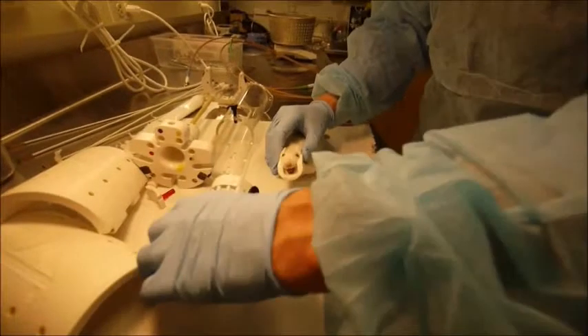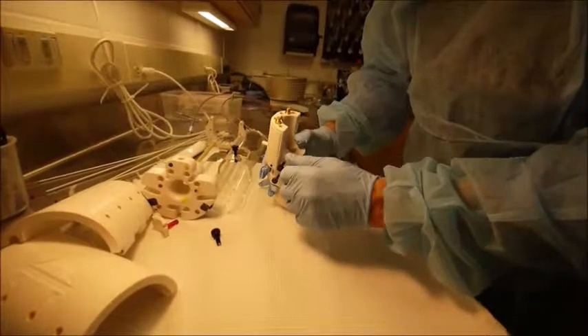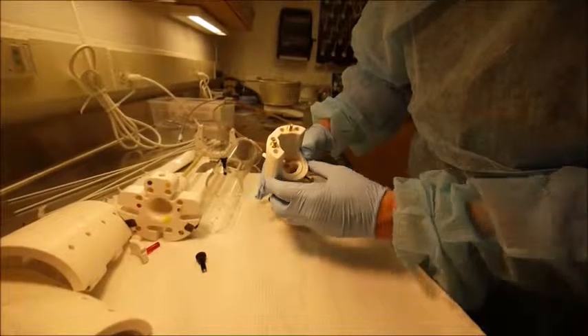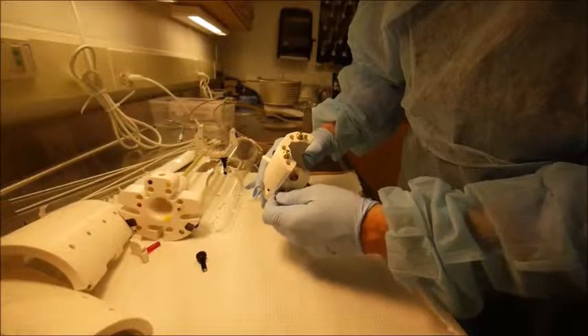Insert the head strap into the coil. It will come to a stop precisely at the level of the side locking screws. Lock into place. Adjust the symmetry of the head by gently rolling the body of the rat, then drop the nose bar and lock into place.